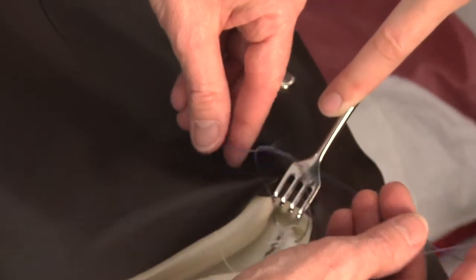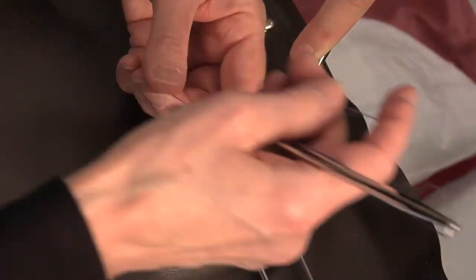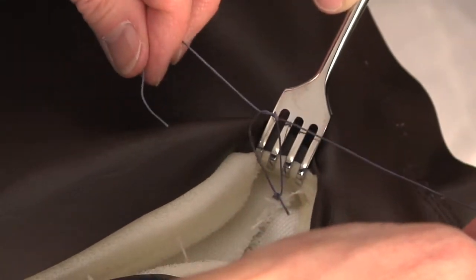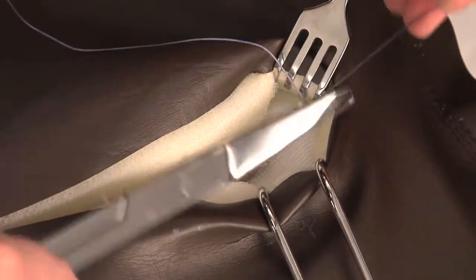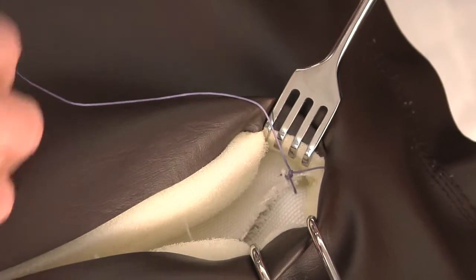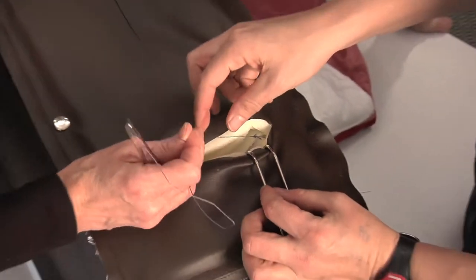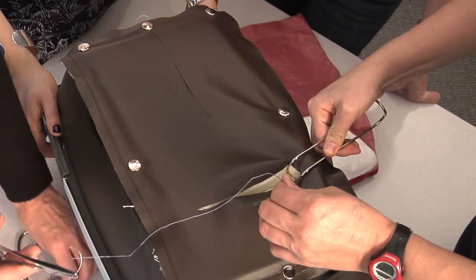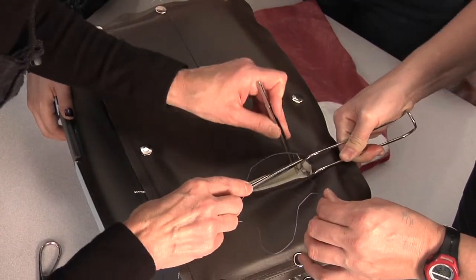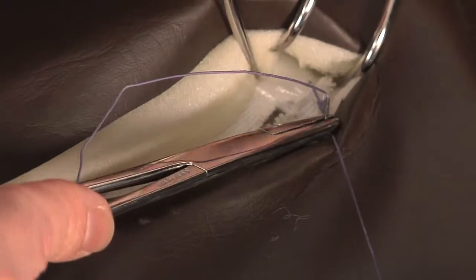This way — and then this way. Sometimes on the first throw people will do two if it needs a little extra tension. That's a slightly different technique, but again that's one of the things you talk about in knot tying. That's two complete knots. The assistant is the one who cuts the suture for you — so you need three hands! I'm going to sew all the way along, so I need to see this side a little better. Once you've got started it's a little easier to see — same on the other side.